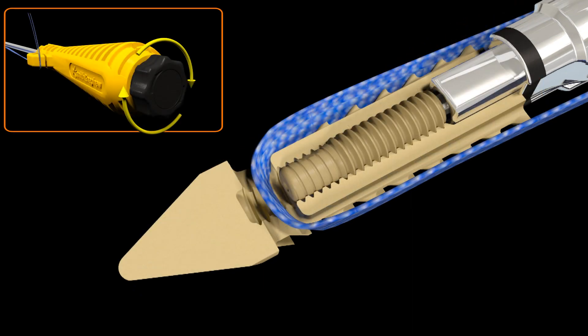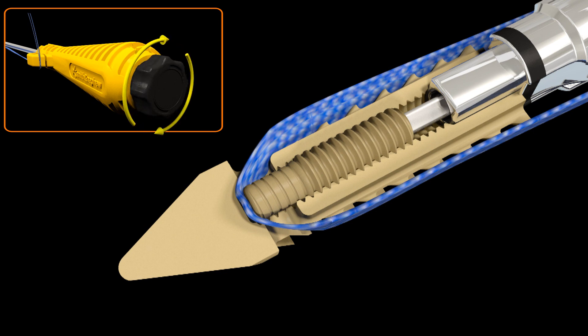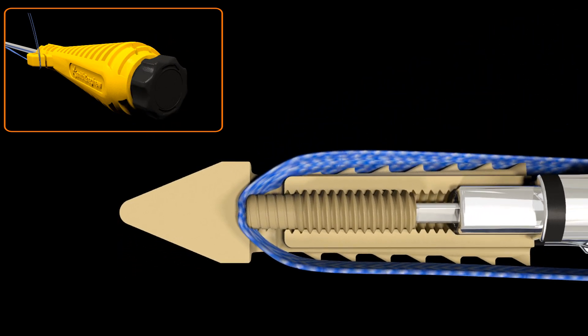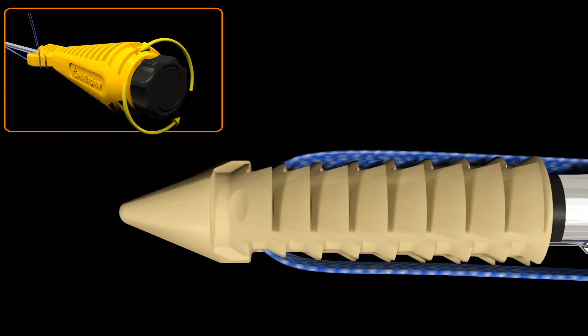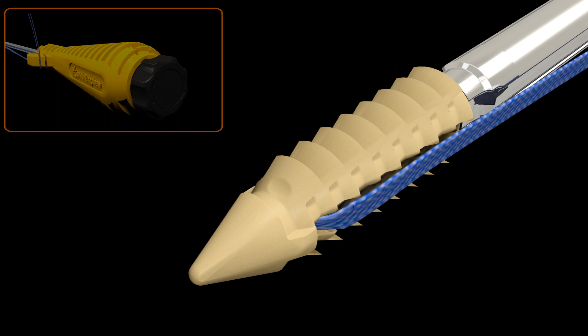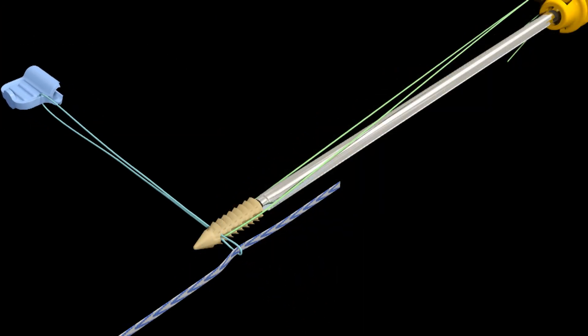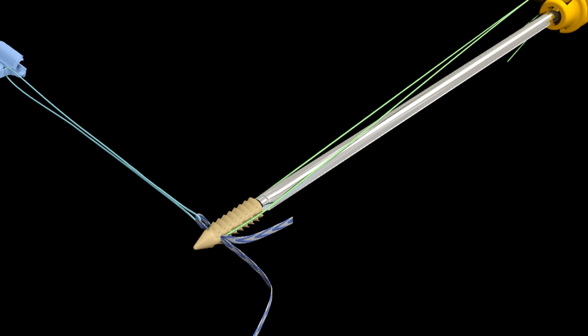At this point, the green stay suture is removed and discarded. Rotate the knob clockwise until a loud click is heard — this click acknowledges that the interlocking screw has deployed and the Ultra Tape is locked internally in the anchor. Now rotate the inserter knob one quarter turn counterclockwise to allow for easier separation of the anchor from the inserter.